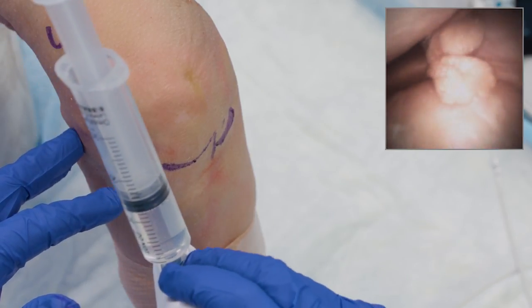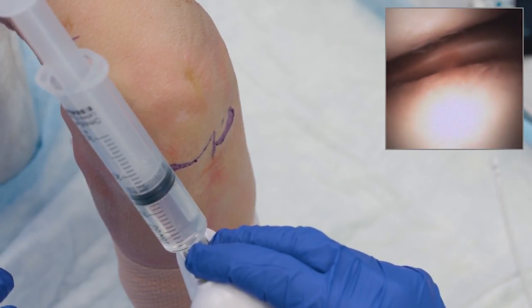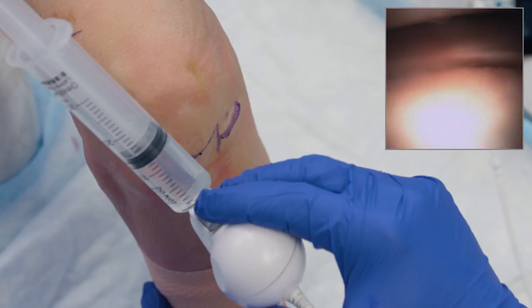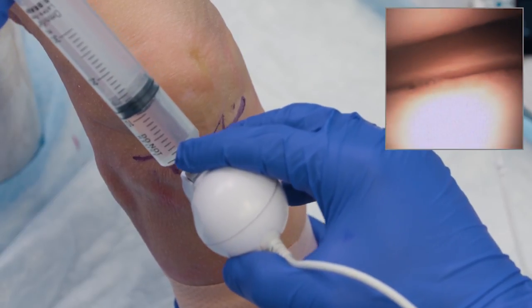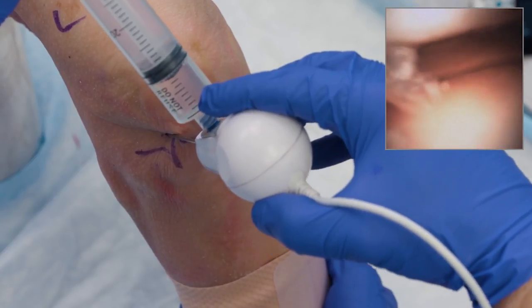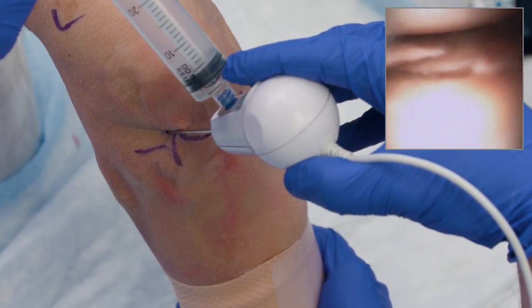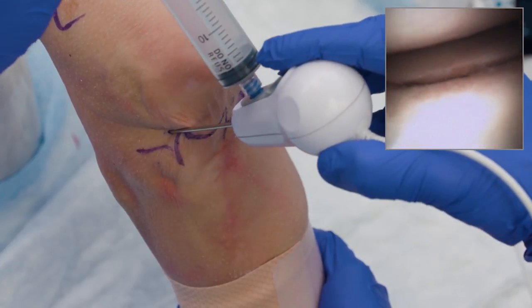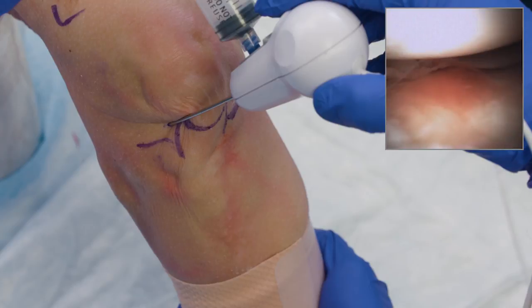Continuing from the lateral portal, I gently move my hand toward the midline and enter the lateral compartment without much maneuvering. Just like in surgical arthroscopy, putting the leg into a bit of a varus thrust helps gap the knee open. A little flush clears the view. Looking at the posterior horn of the lateral meniscus from the root coming around toward the mid-body — I can see there's a loose body floating in the field. I can get in and look at the meniscus, the femoral condyle cartilage, and the tibial plateau cartilage. When done, I can see the arthritic changes on the tibial plateau and the degenerative tear of the lateral meniscus.